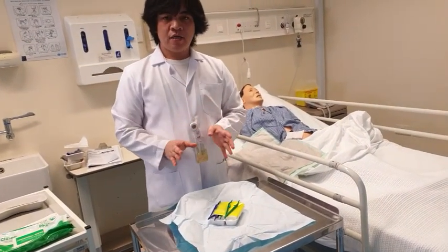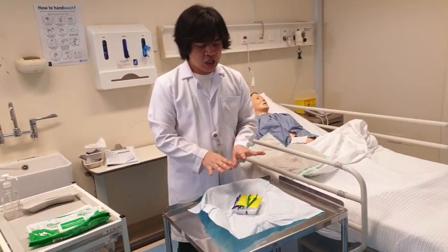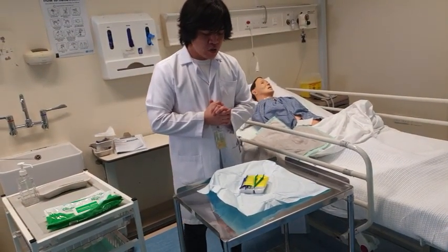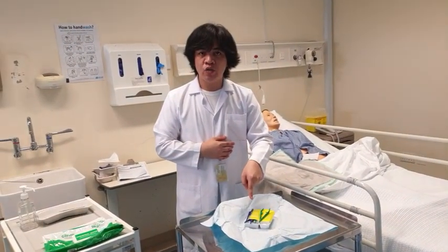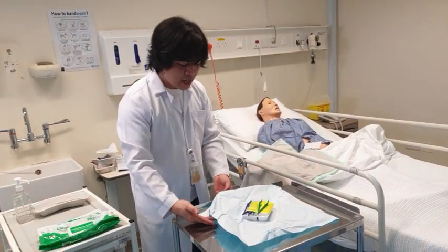Remember, this material is sterile and I am on my bare hands, so that means I cannot touch this one with my bare hands. Okay? So now I'm going to set up this one. How I'm going to start? I need to pick the yellow container, because it is where we're going to discard our used materials. How I'm going to do that?